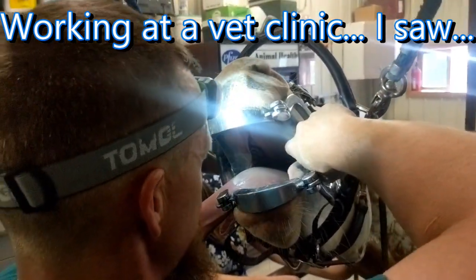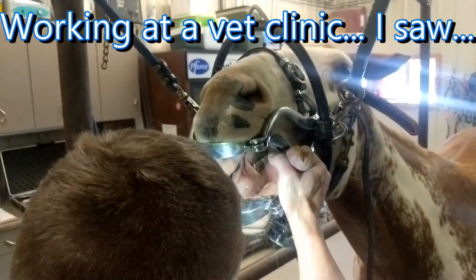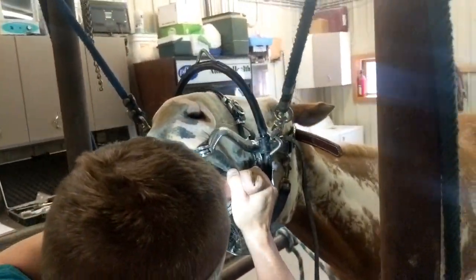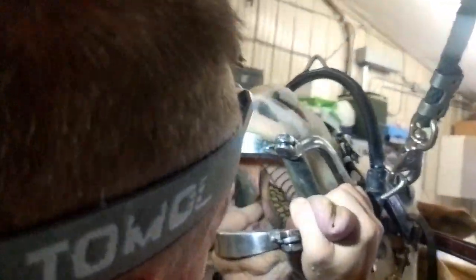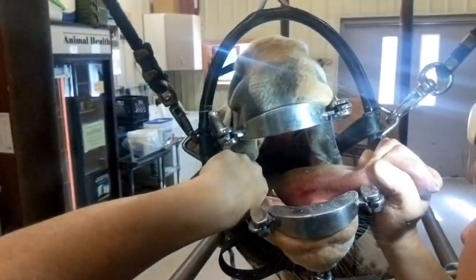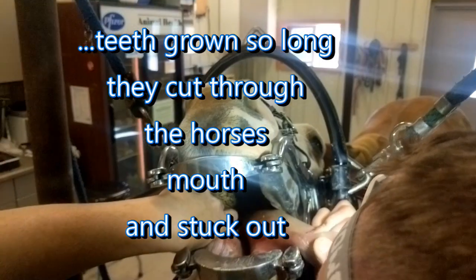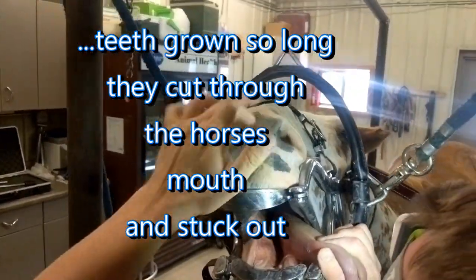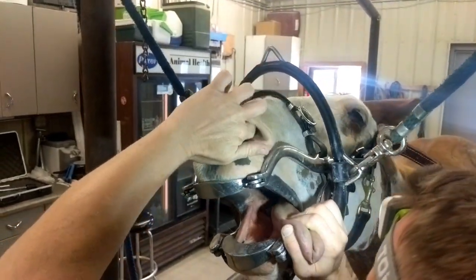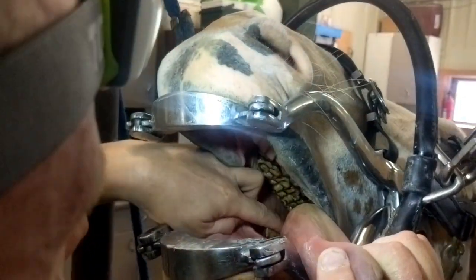It's better on that side. So Kate, before you sit down in there — you can have light so I can show you — those sharp points, like at the end of this finger right there. You can see some ulceration back there in the back, and sharp points right there.